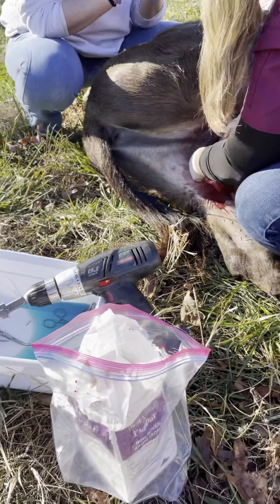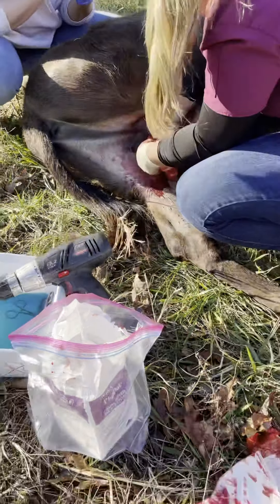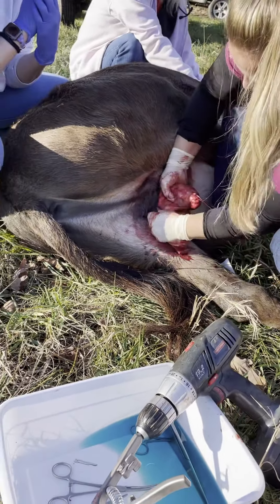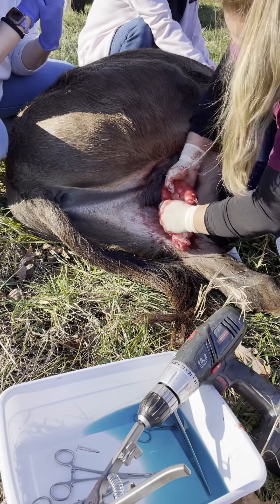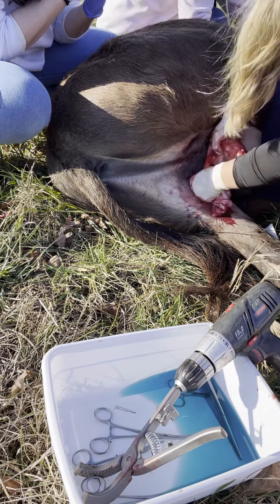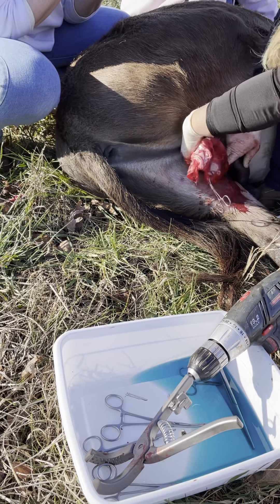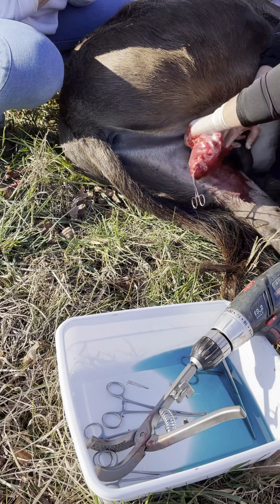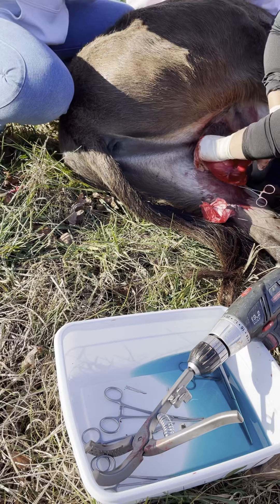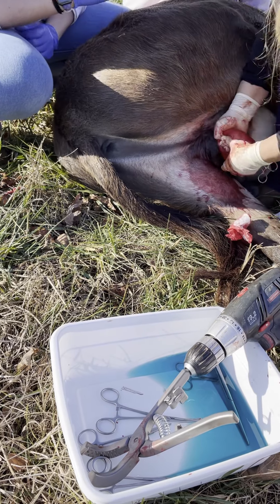Just trying to dissect at least just around where my clamp is and then I can get it done. I don't know where my clamp will be once I put it on. This is why people don't like to do donkeys. It's okay, we're going to get through it, no problem. I just need to get all this fat off of it.